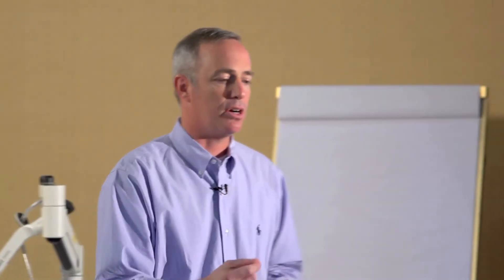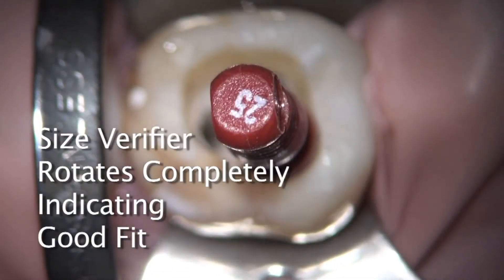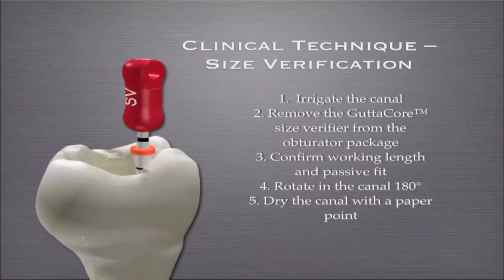My guess is in that clinical scenario — and I see this all the time — is that a 25 would feel too loose, that your 25 size verifier would want to go beyond the working length. So by just tweaking with the size verifier slightly, you can create the ideal shape for that carrier that you're going to place. The size verifier goes in, it's placed with just a 180 degree rotation. You just want to make sure it fits passively, comfortably — not too big, not too small, just right.